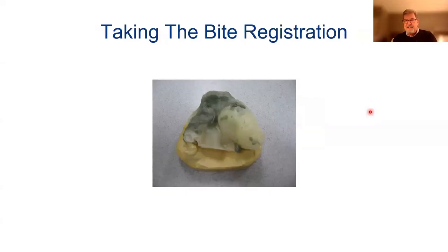How about this bite registration? This is an actual case I got in the laboratory. I don't know what kind of wax the doctor used on this. It looks like beeswax or Alu wax or whatever it is.